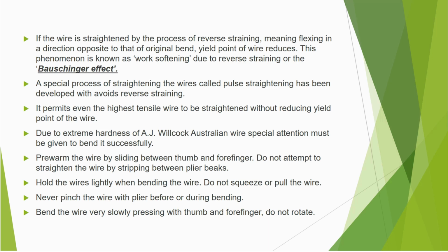Hold the wire lightly when bending the wire. Do not squeeze or pull the wire. Never pinch the wire with pliers before or during bending. Bend the wire very slowly, pressing with thumb and forefinger, and do not rotate it.